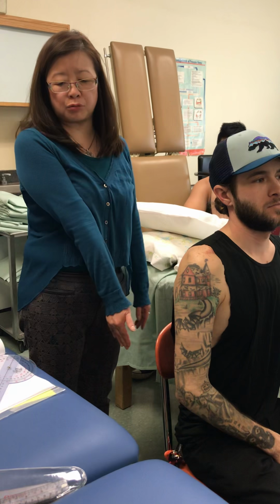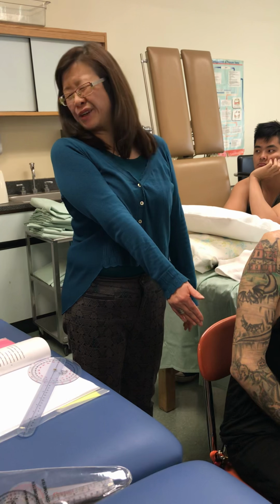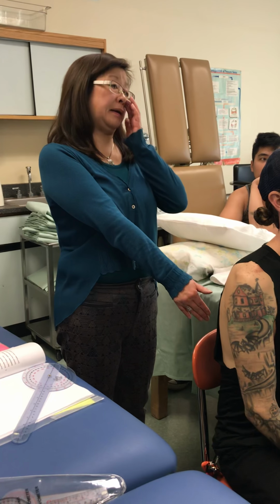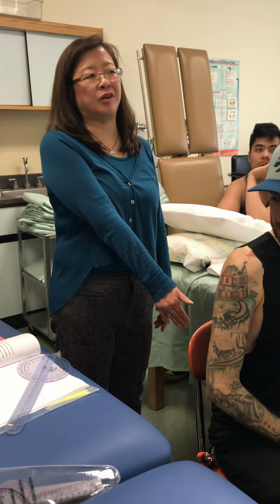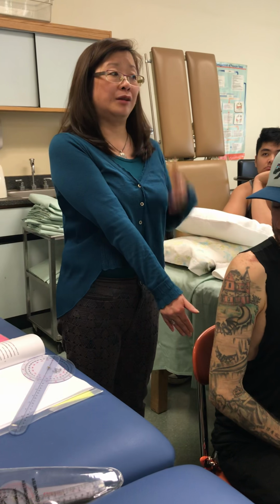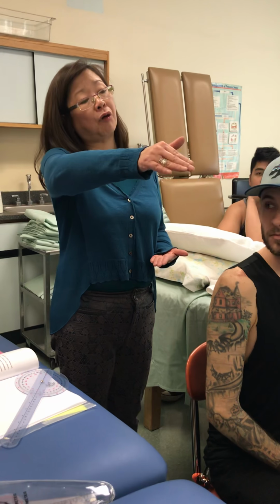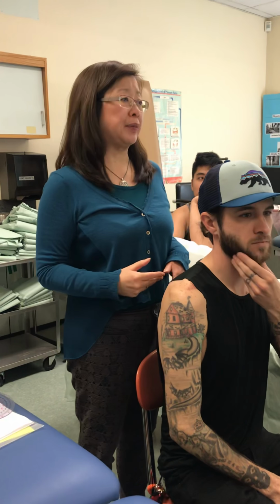Because if I do this, what's this almost? Well, we don't call it hyper. We call it what? Cross adduction. Can I measure cross adduction really well here? Do I have good landmarks? No. Looking at the landmarks we've been using. If I want to measure cross adduction, I would measure horizontal adduction. So that's why we're jumping into horizontal AB, AD.